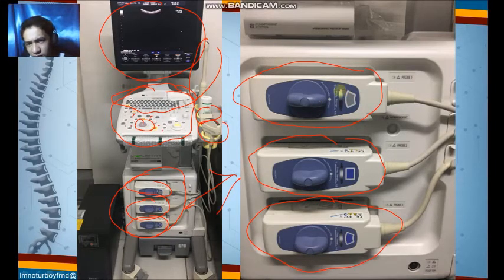And as you can see, there is an annotation here showing what frequency is being used. Like for example, this is number 1, this is number 15. So that is the frequency, and the white portion is directed towards the number 1. That means this is a low frequency transducer.